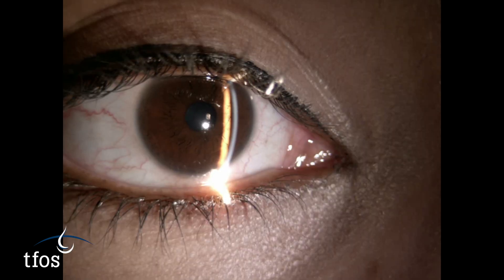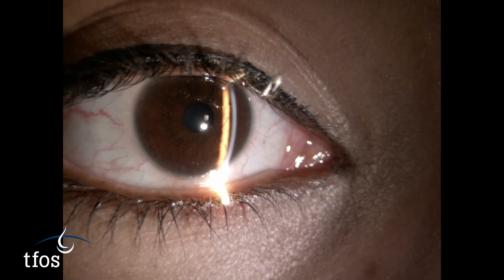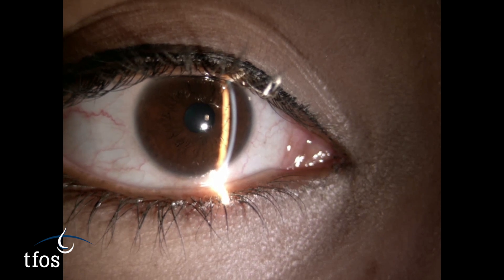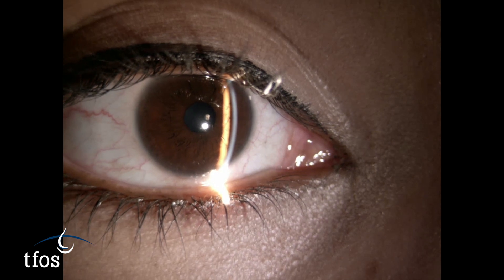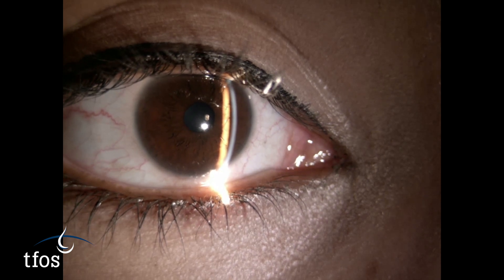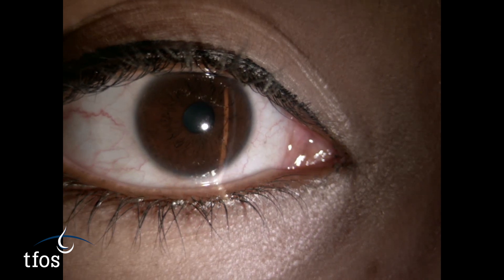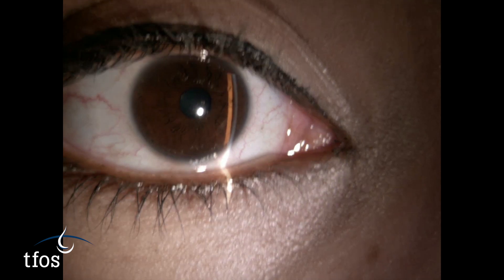Without access to specialised instrumentation, a slit lamp or microscope can be used to estimate tear meniscus height. With the patient seated comfortably at the slit lamp, project a narrow-width beam of low to medium intensity over the central area of the lower lid margin and increase to medium magnification.